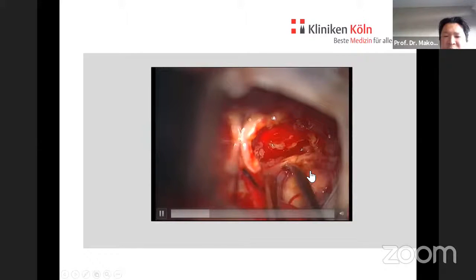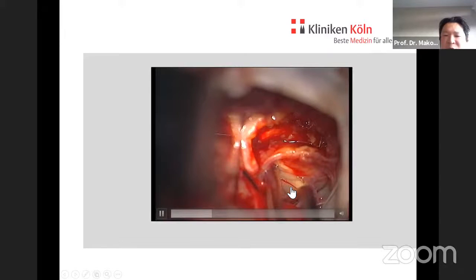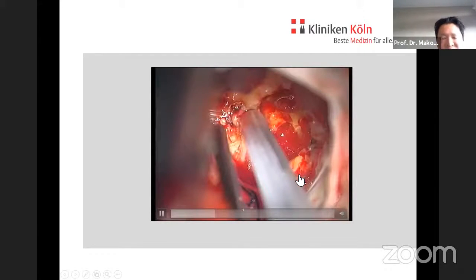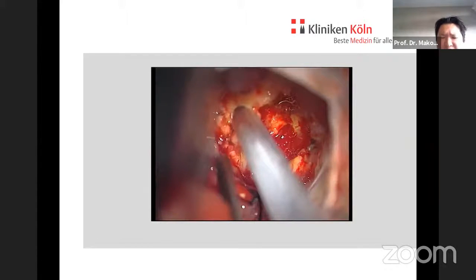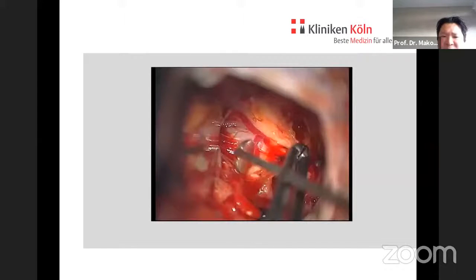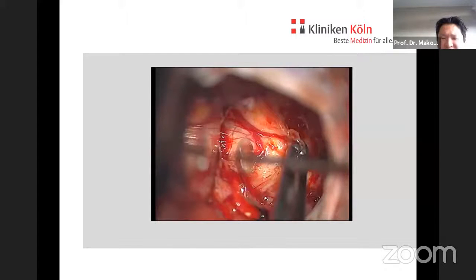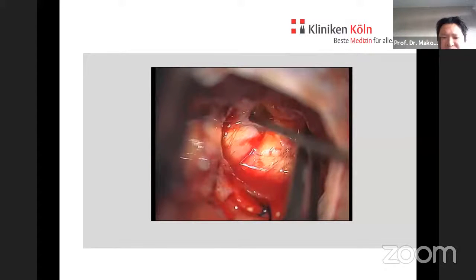So this tumor gets soft. And then you can have more anatomical orientation. Otherwise you don't have any orientation. You don't even know where the facial nerve is. And so in my view, the first step should be decompression of the tumor and then mobilizing the tumor just right at the brainstem.